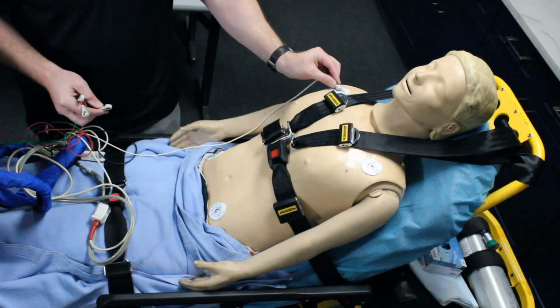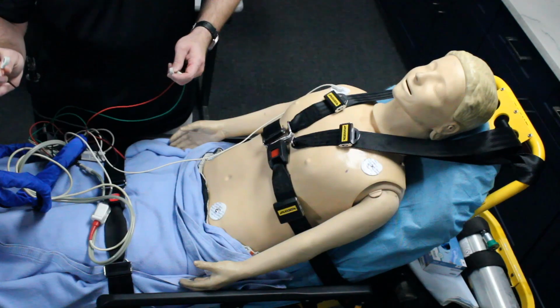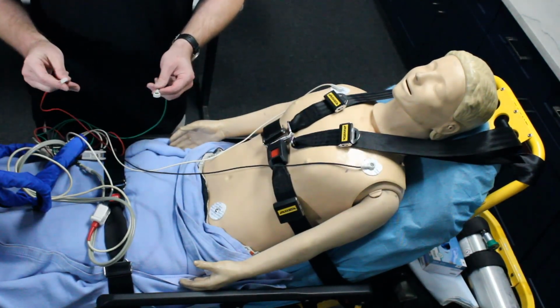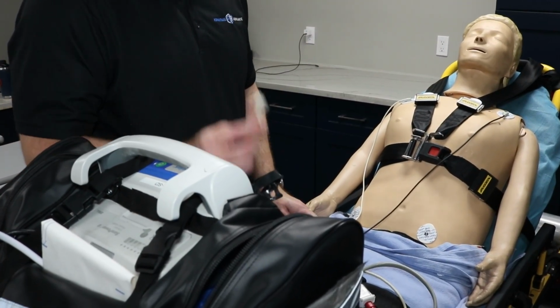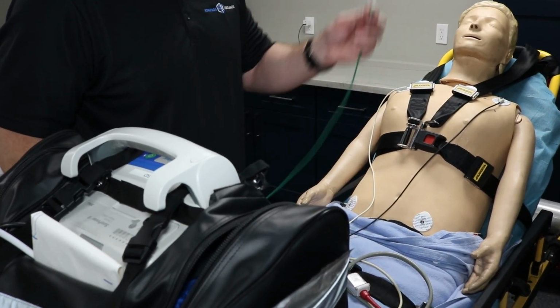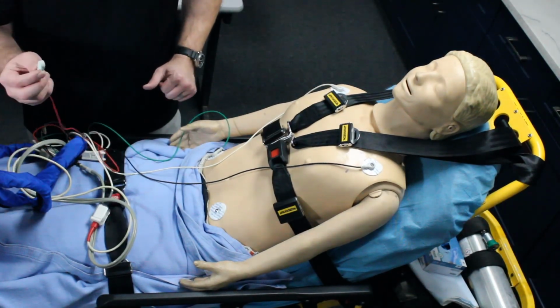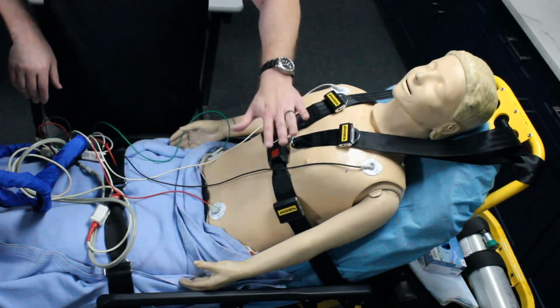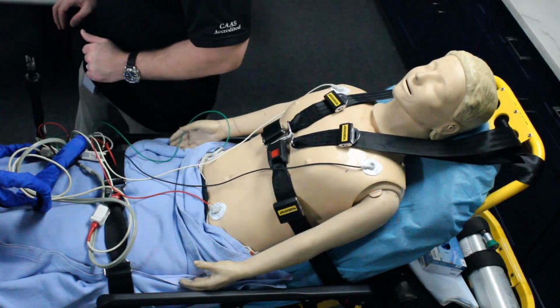Right arm, white, is going to go on that right upper chest, while our black left arm is going to go on that left upper chest. We have 2 more here. We will have RL for right leg and LL for left leg, or we can attach to the lower abdomen here. Green is going to go on the lower right of the abdomen, and our red is going to go on our lower left of the abdomen. That's all we need to do right now for our leads. We have all 4 connected. Next, we are going to hook up our blood pressure cuff.